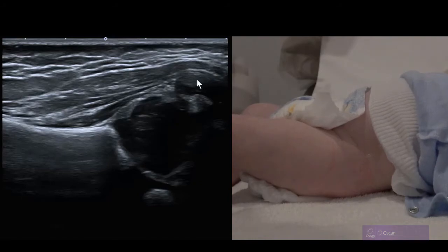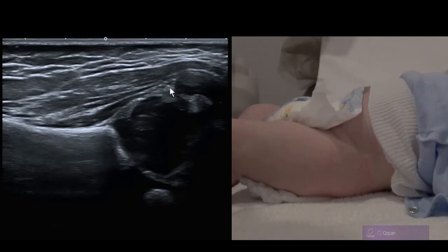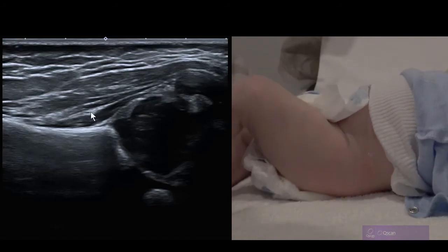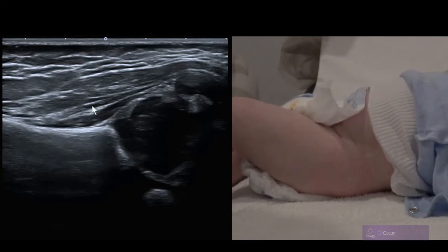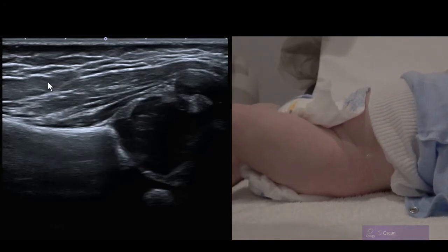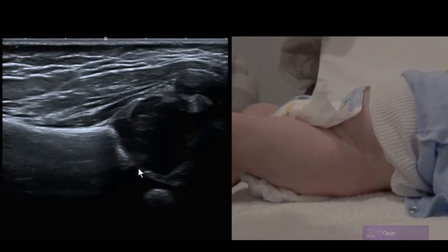The greater trochanter is also seen here with the synovial fold, which is slightly echogenic. Then the gluteus minimus, the medius, and the overlying soft tissues. This is the pubis on the medial wall of the acetabulum.